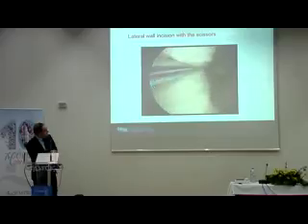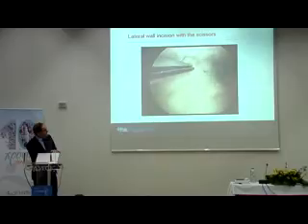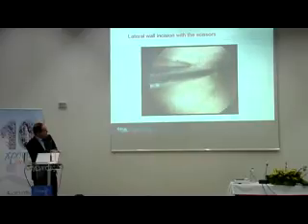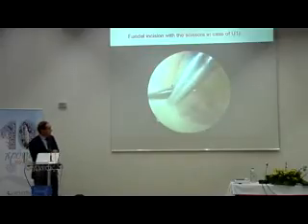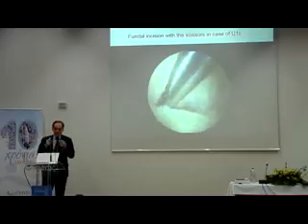So it could be of importance, and covered behind this little piece of tissue, you have the tubal ostia, and you make a straight line until you have the vessels, or until you have a correct anatomical performance. If you have in the midline also a thickness of the wall, again here we cut. And again here you see that there are no vessels.